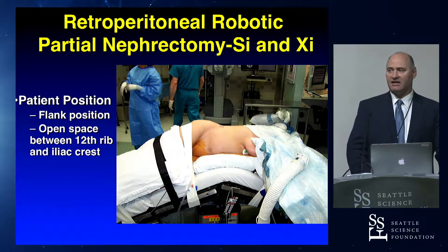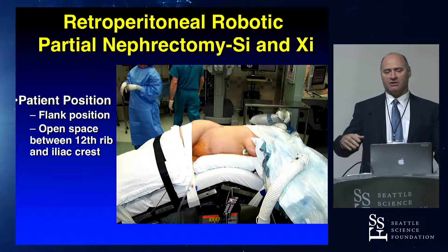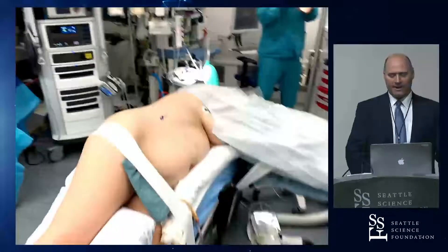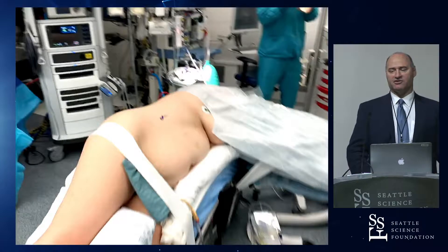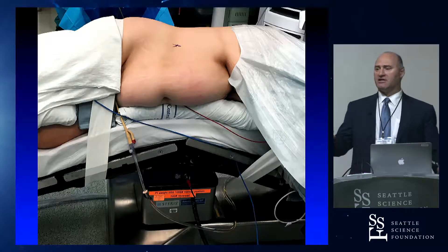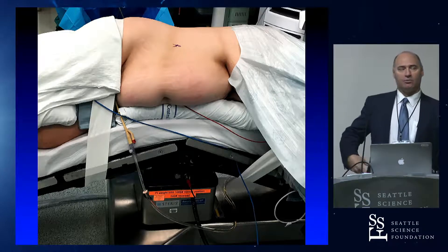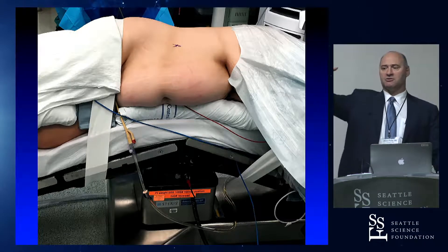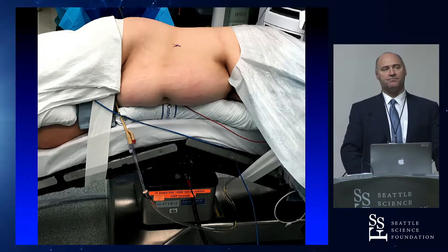The patient position is the same for the SI and the XI — it's a full flank position. The idea is to open the space between the 12th rib and the iliac crest, so you want to fully flex the patient. I don't use the kidney rest. All I do is make sure the patient's umbilicus is at the break in the bed, and then we fully flex them. I use tape and rolls — you don't need a beanbag. For a very hippie woman with a large hip, you should move the break even a little farther cephalad so the umbilicus is below the break, which will drop the hip down when you flex them.